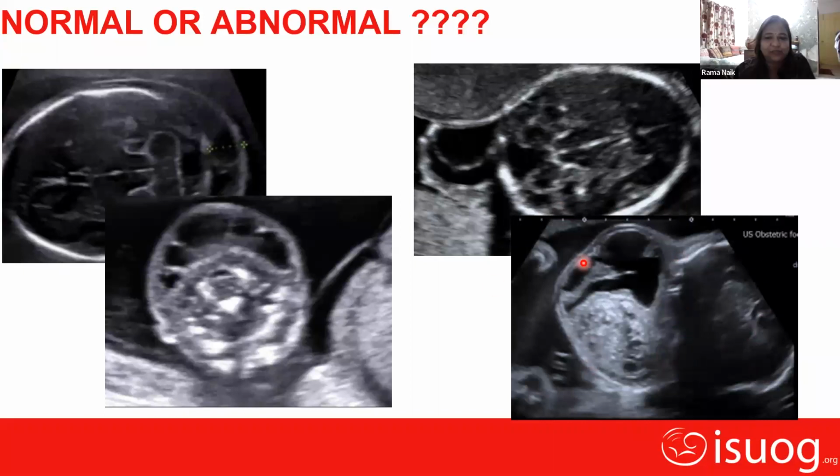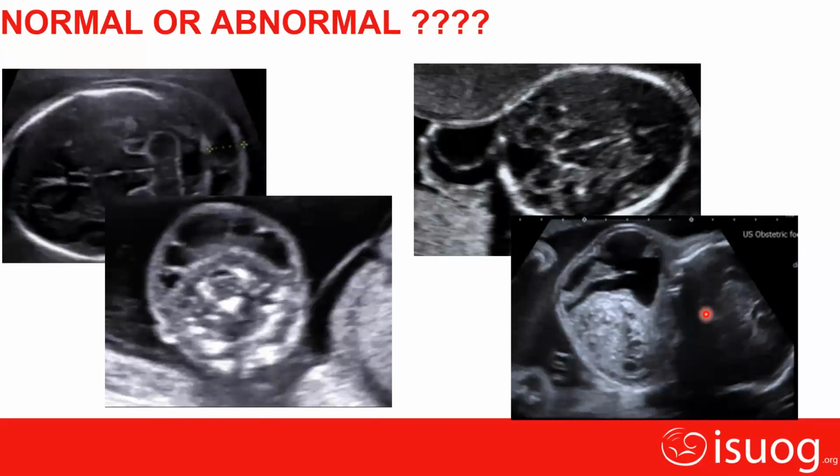And this is the last picture. Cervical teratoma. This is the head portion of the baby. This is the neck, which is extended. We can see the solid portion, also calcified, so big. So this is the teratoma, which is rare.